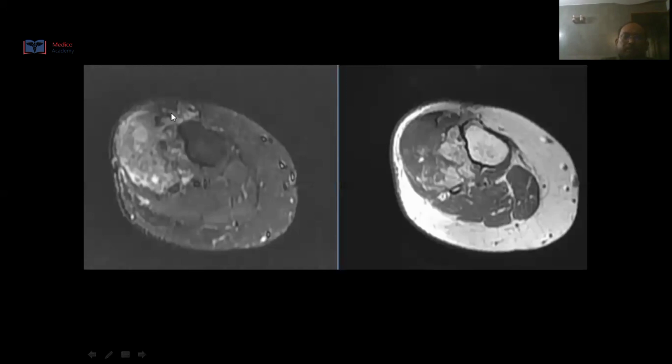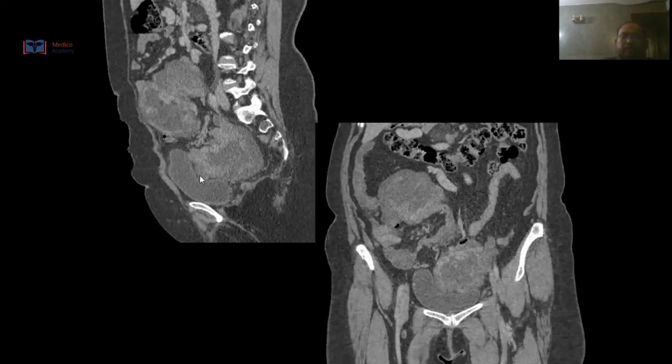This is another example where there is some heterogeneous calcification, and there are some areas of hyperintensity, and there was no significant enhancement. So this was a case of an infective cellulitis. This is another case where there are multiple intraperitoneal soft tissue masses, and this came out to be intraperitoneal soft tissue sarcoma.